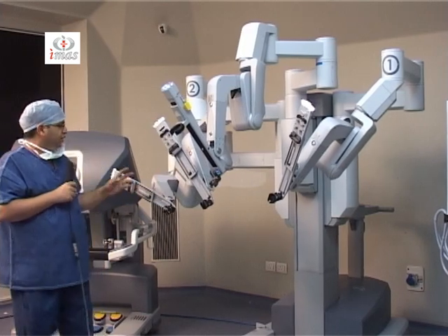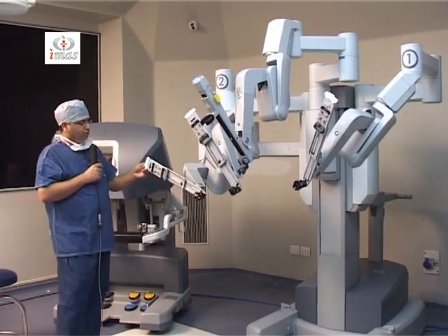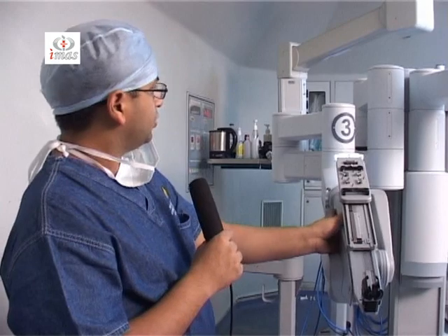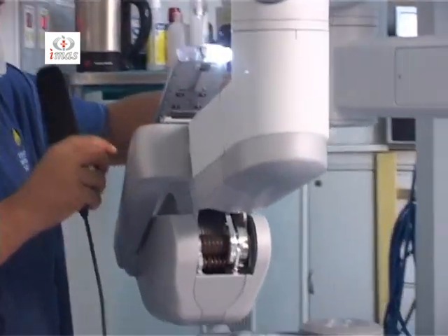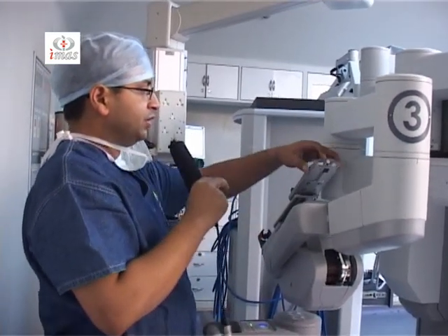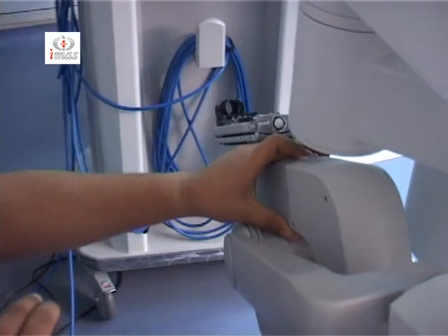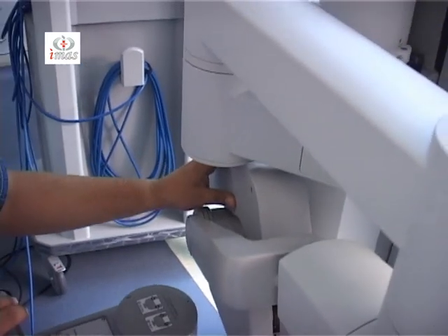This is again the second instrument arm and the third instrument arm. The third arm can be taken from both sides of the cart, as I already told you. Now the third arm has to be brought behind the patient cart. So to store the third arm, you have to bring it here. The third number should face towards you. Pressing the port clutch button, you just move the setup joints together. Press this clutch button and just pack the arm and take it behind the setup joint and move it down.